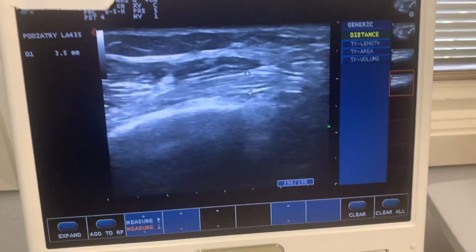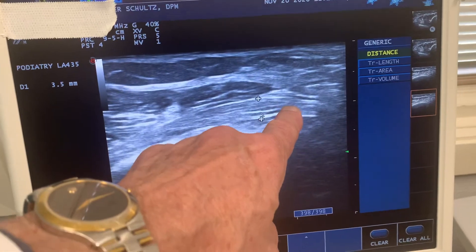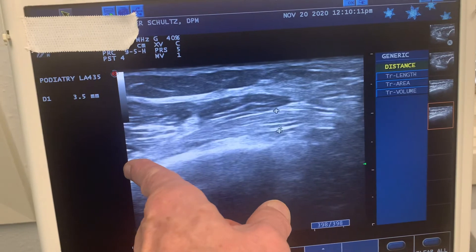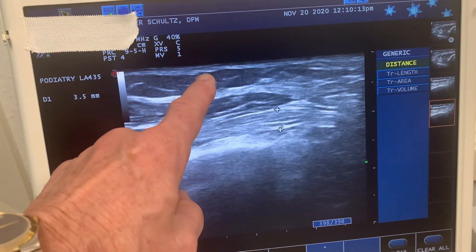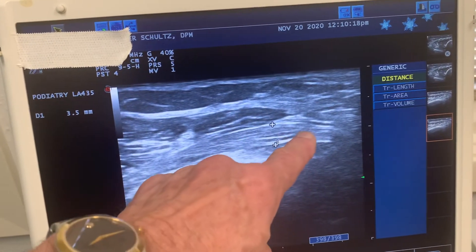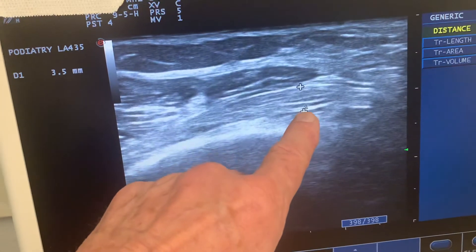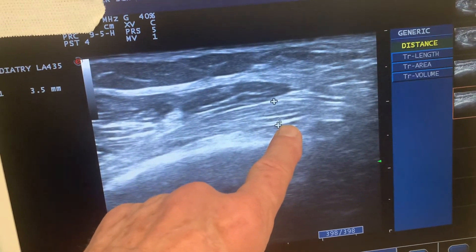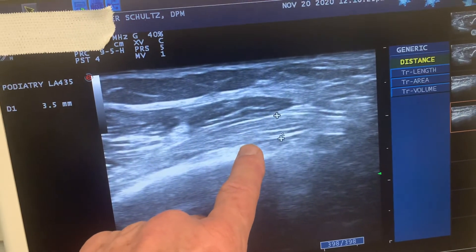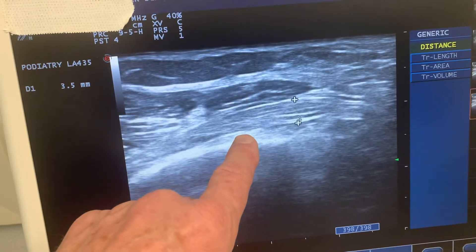This is her ultrasound, and I'm going to point this out — this is the nerve. That would be up towards the hip joint, and that would be down towards her ankle. The skin is here. And this area right here is a muscle that this nerve goes beneath. So what we do, we measure this nerve. You can see this is the nerve before it dives beneath this muscle compartment. This muscle compartment gets very tight, and we can measure the dimension here. You can see down here the nerve is smaller.